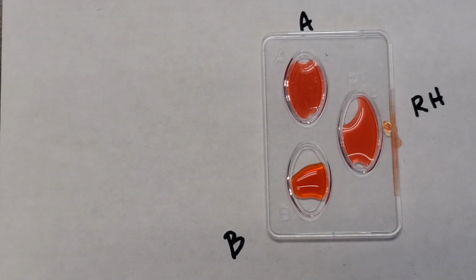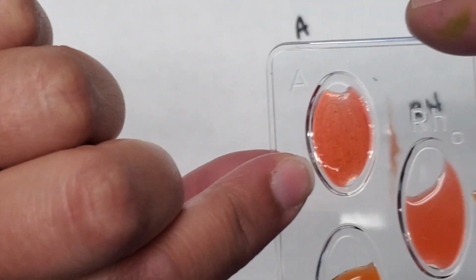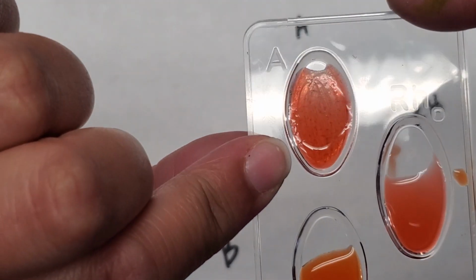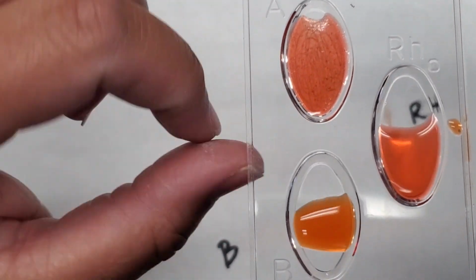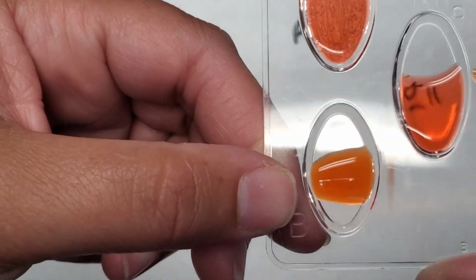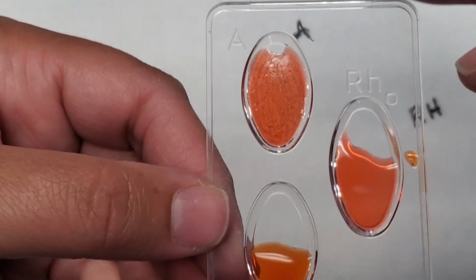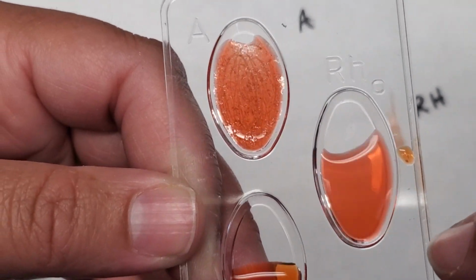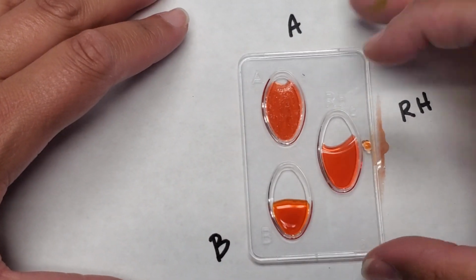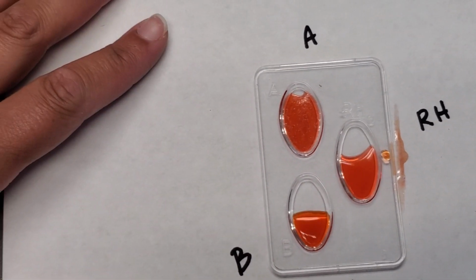When we're looking for all of this, clumping can look like a few things, and I've mentioned that already. It can actually cause the blood to become clumpy. If we look at this one really carefully, you can actually see the little tiny specks in it. That is a positive agglutination reaction. If we look at well B, the color might be a little different, but it's still fluid. There's nothing in it, so that's actually a negative reaction. The Rh well is a little hard to see, but I actually have these little tiny clear crystal-like specks in it.